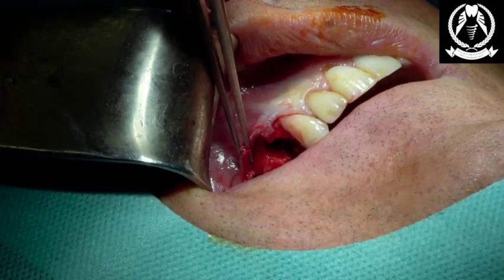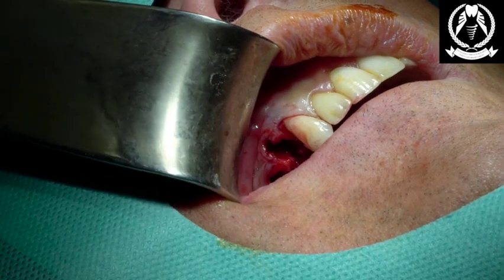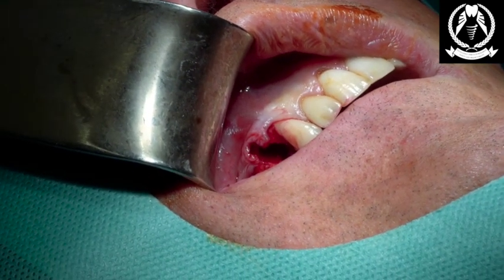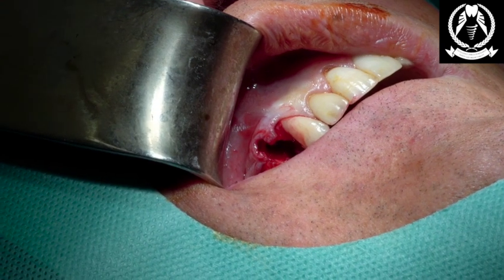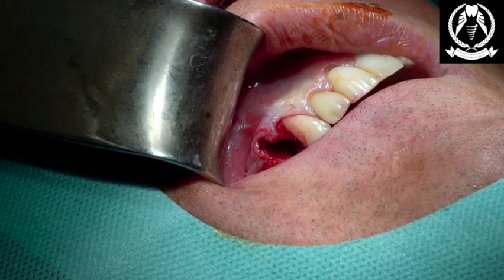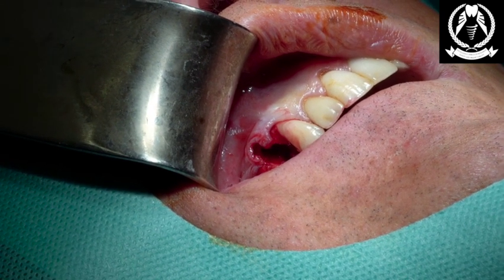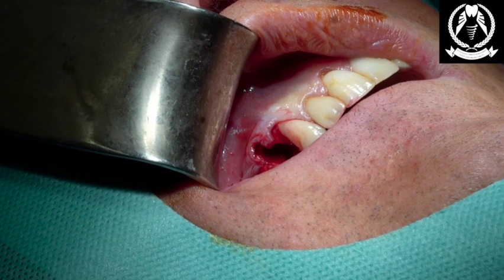We're going to try to parallel these up. Right, so what we need to do, I'll just triangulate this CT scan for a second. You can see the root is slightly mesially tilted on there, so we're quite safe to go a little bit distal of the socket. So this is how we're going to play this.